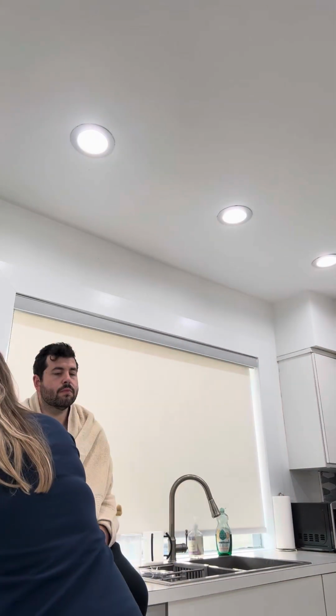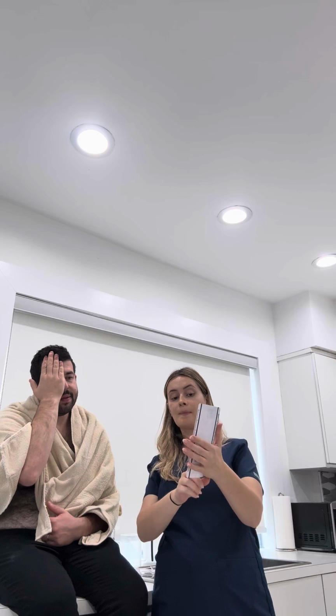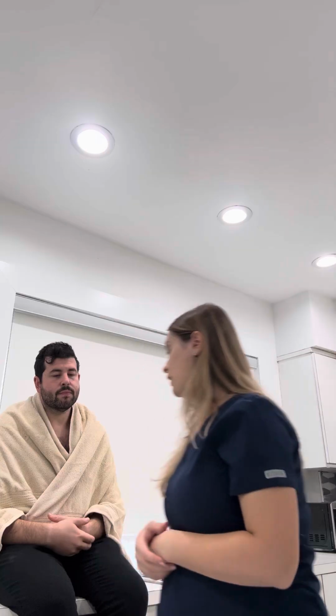Now I'm going to be testing your vision. Okay. All right. Do you wear any glasses? Okay. Or contacts? Okay. Cover your right eye and read the last line. LTFPH. Good. Other side. And read it backwards. HPFTL. Good. Okay. Visual acuity is 20/20 uncorrected.